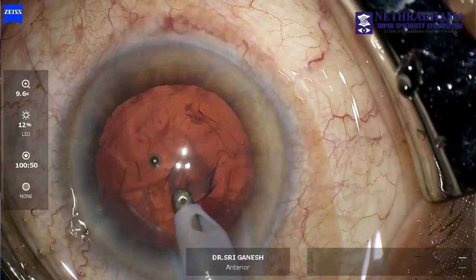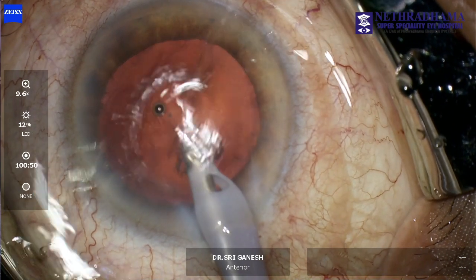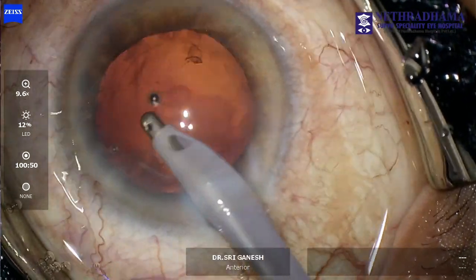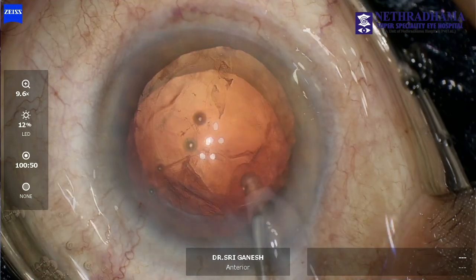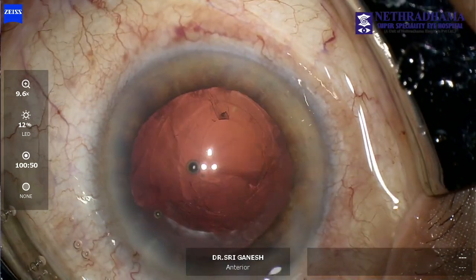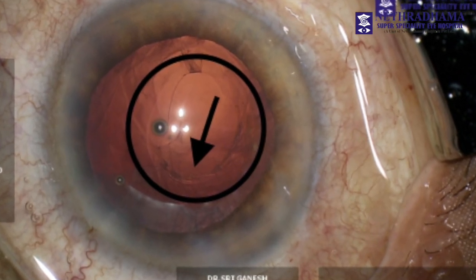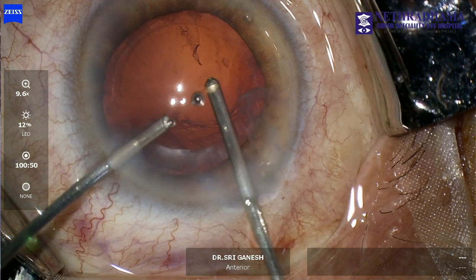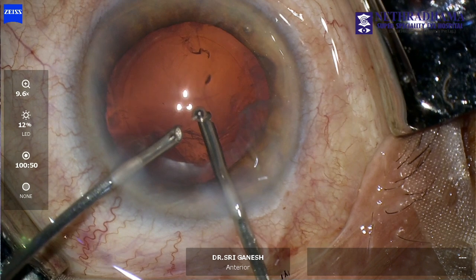Here I am using a coaxial IA, which is not ideal in such a situation, because as you can see it is difficult to reach the sub-incisional cortex and when I remove the probe again the vitreous prolapses. This is because there is hydration of the vitreous with the coaxial cannula. I go in again and do a vitrectomy to clear the vitreous from the anterior chamber.